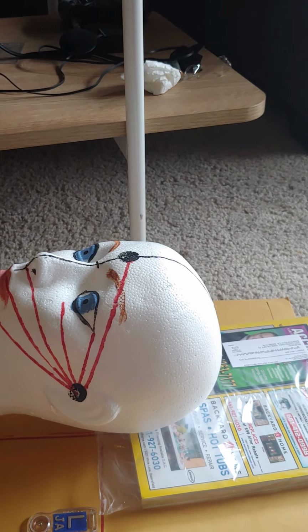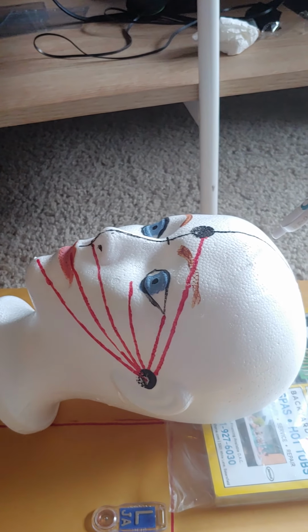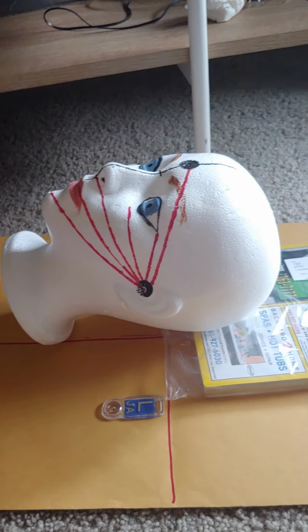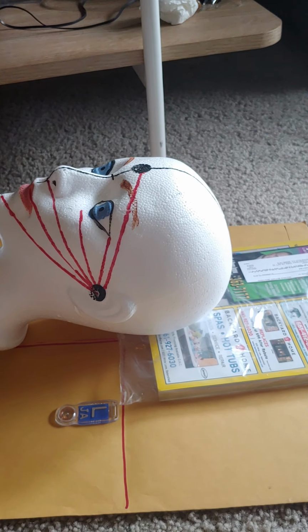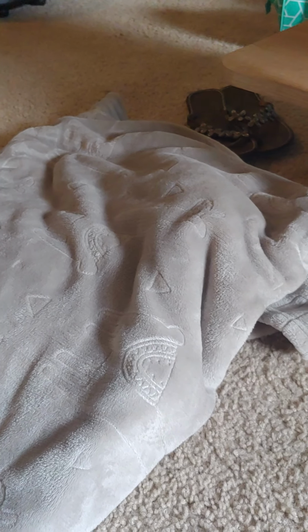The entrance point is about 2.5 inches superior to the glabella. For this projection, you want the dorsum sellae to be within the foramen magnum. I have a left marker to indicate which side was the patient's left side, and my patient is still shielded.